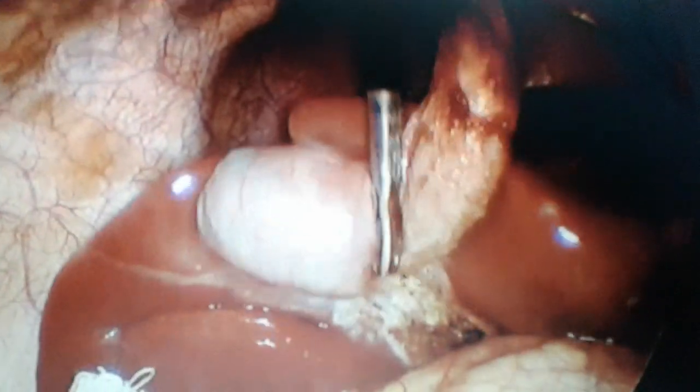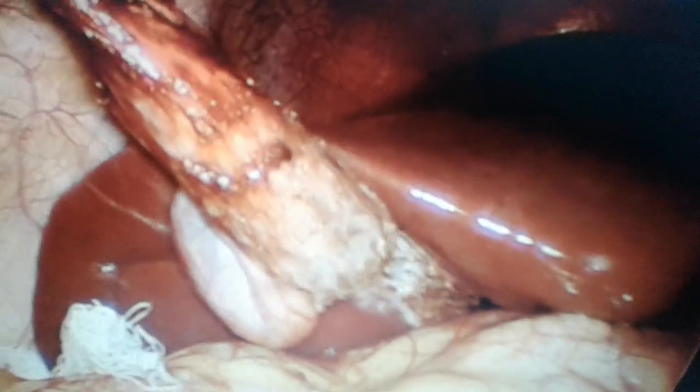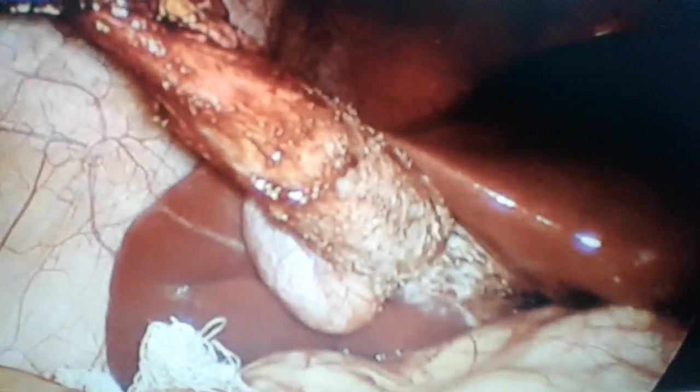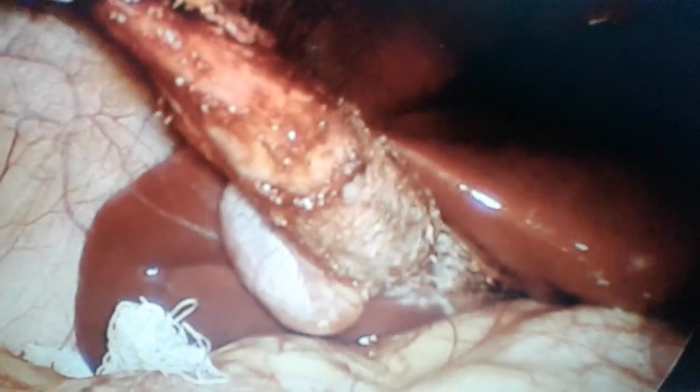They catch hold of the cut end of the gallbladder like this. The gauze piece is still lying. And just continue your dissection if possible.